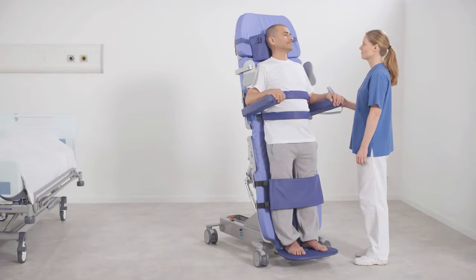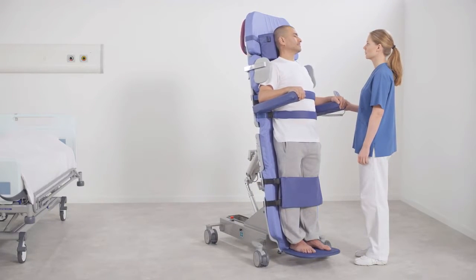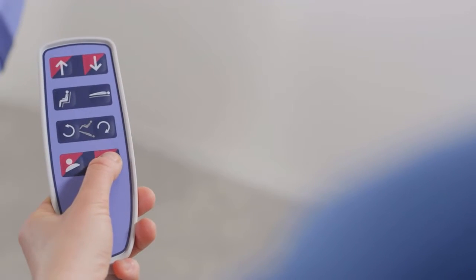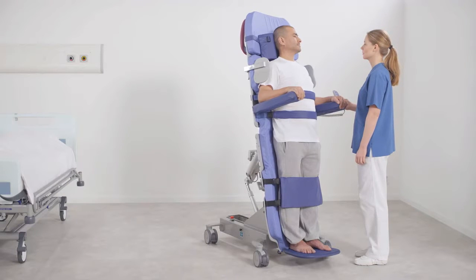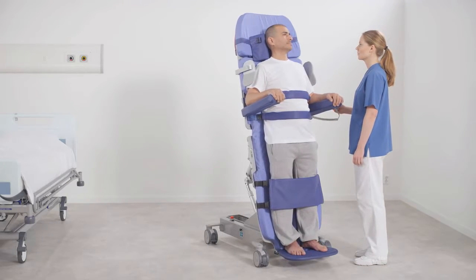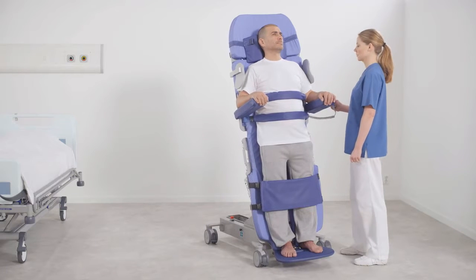Sideways tilting of the Sara Combilizer is possible in all positions, regardless of whether the patient is standing, sitting, lying down, or even in Trendelenburg position. To tilt sideways, press and hold the sideways tilt buttons on the hand control. The sideways tilting will stop for a few seconds at the center position. If the button is kept pressed down, the lateral movement will automatically resume.